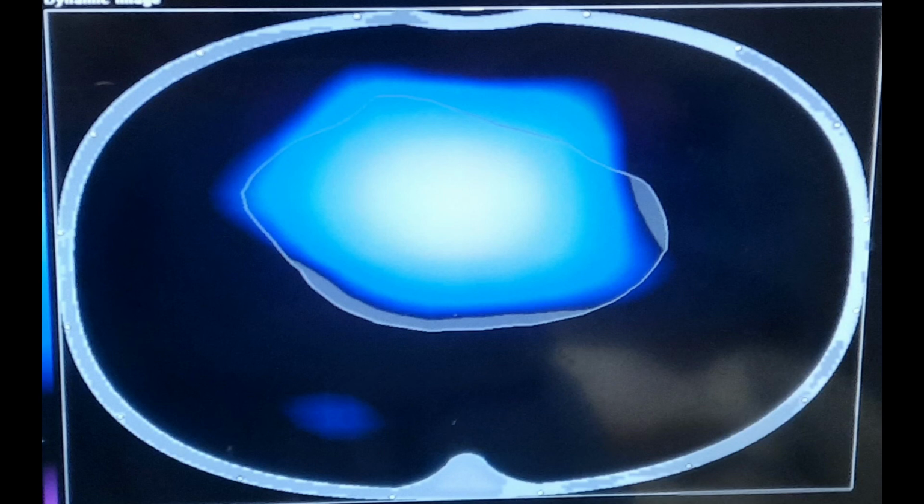Therefore, this could cause atelectotrauma, increased strain on the alveoli adjacent to the collapsed ones in the dorsal region, as well as the reduced surface area of alveoli would increase the amount of stress in the ventral and mid-ventral regions. Without the electrical impedance tomography to get this regional distribution of ventilation, we probably would have never known that the patient had any of this collapse in the dorsal region.